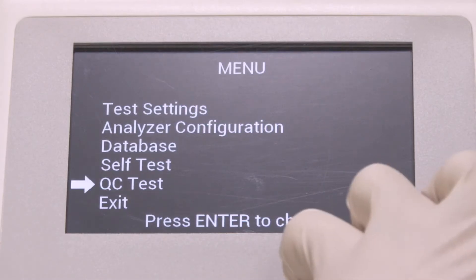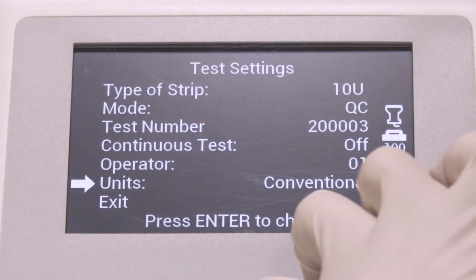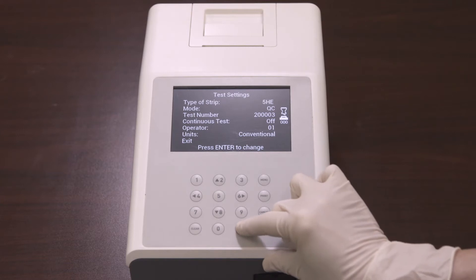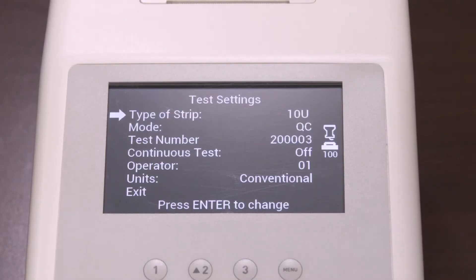Start by selecting the test settings to input the type of strip and pressing Enter to change the strip type. Each strip type name defines the number of test parameters, and each press of the Enter key cycles through all options. Keep pressing Enter until the type of strip matches the strips to be used. In this case, we'll use 10 parameters.